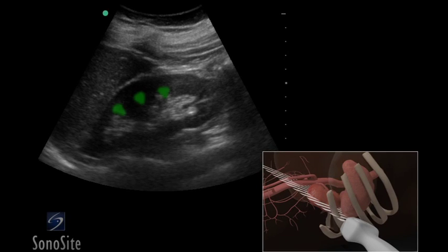The renal pyramids are triangular in shape and darker, or hypoechoic, compared to the renal cortex. The renal pelvis will appear as bright, hyperechoic echoes within the kidney.